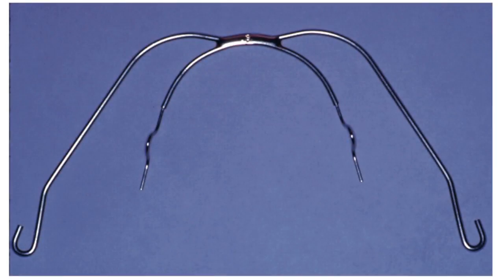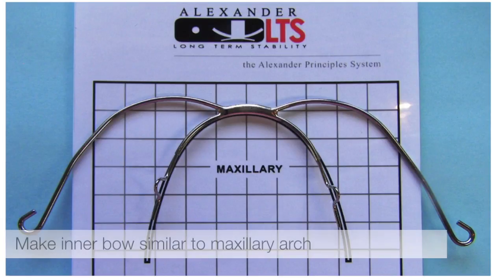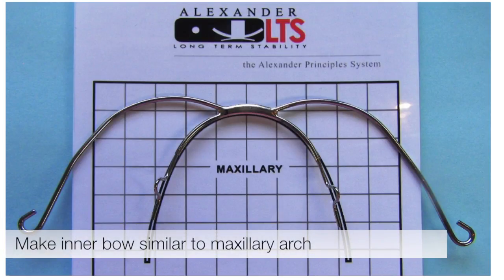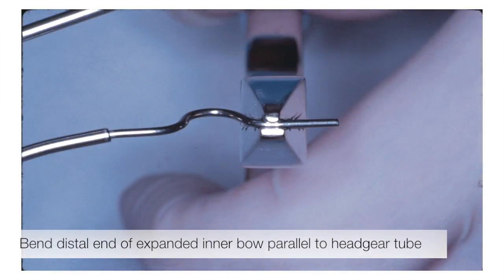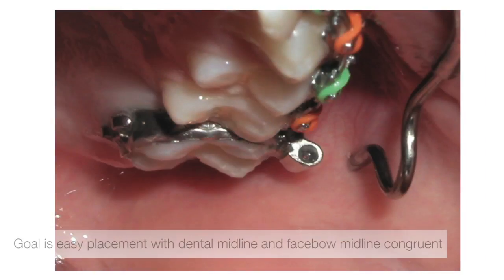The most effective and inexpensive Class II orthopedic corrector is the face bow. Initially you want to make the inner bow of the face bow similar to the maxillary arch. You want to bend the distal end of the expanded inner bow parallel to the headgear tube. Do this one side at a time. The goal is to have easy placement on the right side with the dental midline and the face bow midline congruent. The same placement will be done on the left.